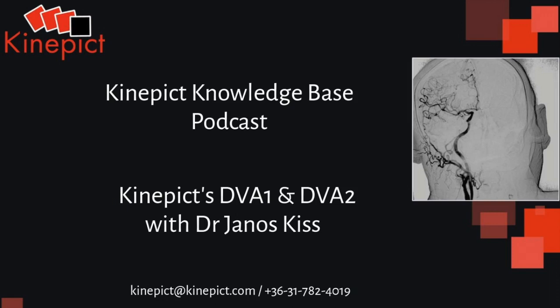So what we observed when we compared the DVA1 and DVA2 in this selective angiography setting was that DVA1 and DVA2 performed very similarly. There was no big difference between them. So there were no advantages of DVA2 under these settings. However, I have to emphasize that, as I mentioned, DVA2 was specifically developed for conditions where the visualization of blood vessels is difficult.